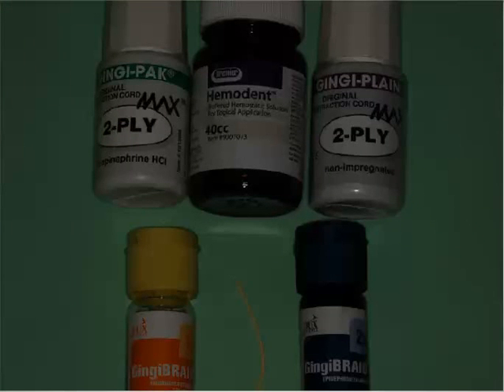And I'm not going through the preparation, but I'm going to show you some of the available options that you have. In probably 90% of the cases that I do, I'm using some type of cord placement. Now, there are a lot of options available on the marketplace. You can have braided, non-braided or non-woven. You can have different widths, single, 0, 1, 2, 3. You can have epinephrine impregnated if you want, and you can also have some type of astringent.